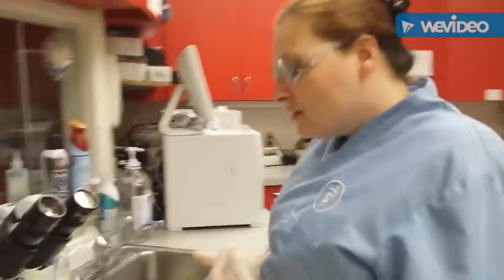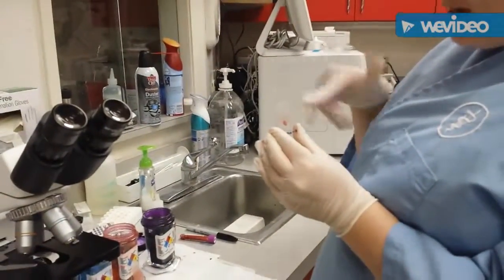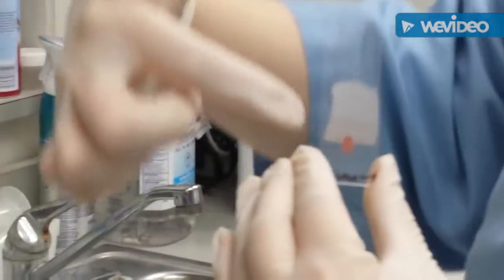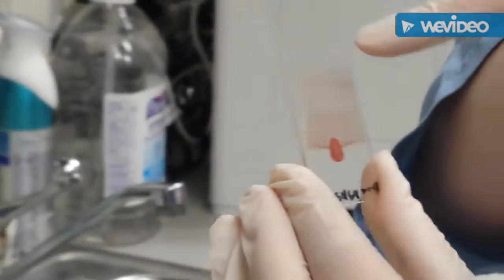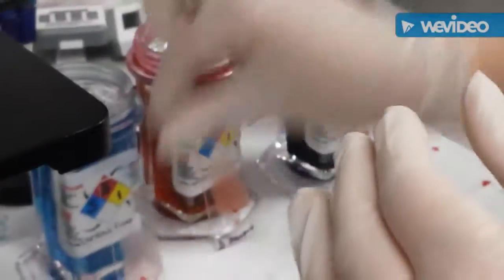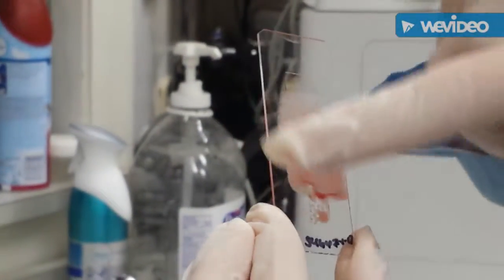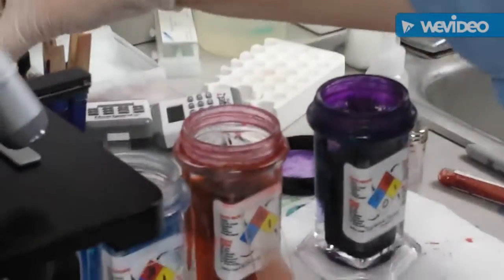Slides have now dried, so we're going to go ahead and take a look at them. This slide goes to about halfway. We do want a space on each side of the slide. We have that on the left, not so much on the right. We do have a nice feathered edge here down at the bottom on that first slide. On our second slide, it's a little close on this edge, but we do have space on each edge, and then we have a feathered edge here.